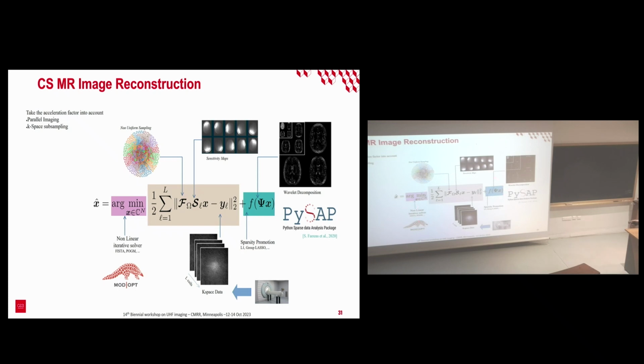And this criteria being convex, you will end up with basically a single solution, a single optimizer. But because, of course, minimizing this cost function doesn't admit a closed form, it's iterative, it's very computationally demanding. Okay. So we will see solutions to overcome this issue afterwards.